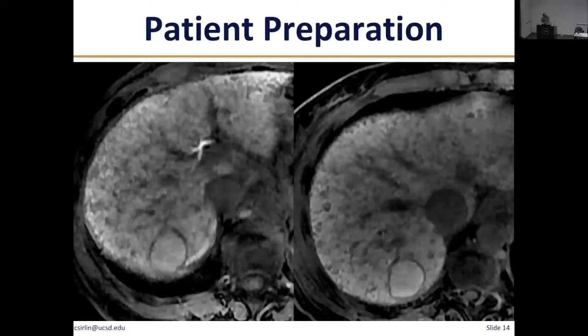expiration? So I want everyone to look at this image, in particular focus on this tumor over here and focus on this tumor over here, and just ask yourself, which tumor looks more clearly demarcated, and which tumor can we see the so-called capsule around the tumor more clearly, which image looks blurrier. Both of these were acquired in a 20-second breath hold.